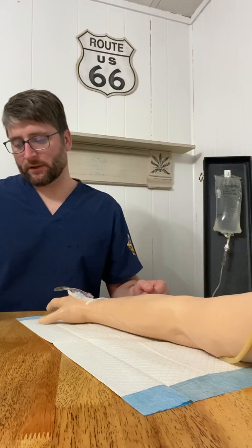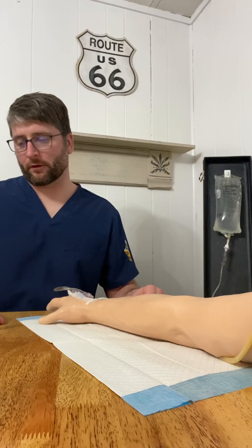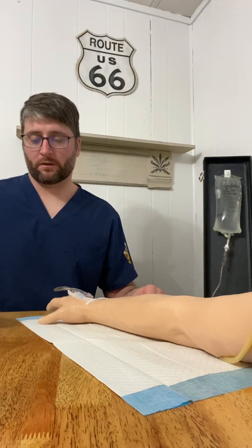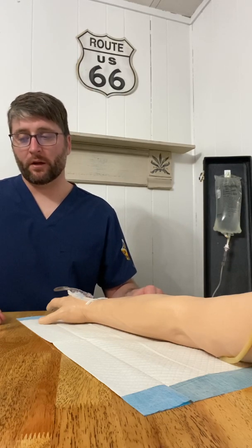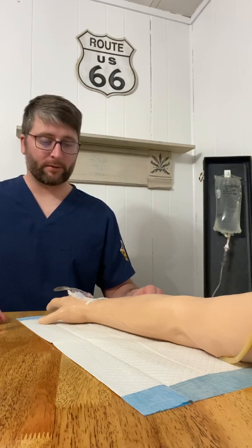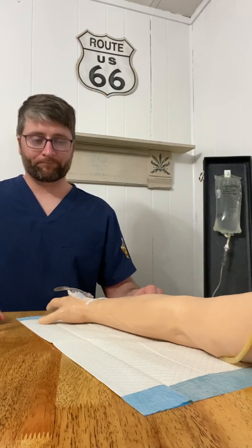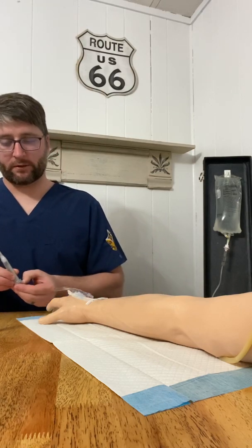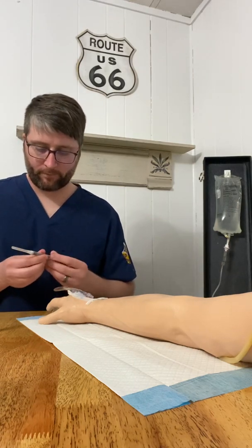We are going to be giving 1 milligram per 500 milliliter. This medication is 1 milligram per milliliter, and we're going to put that into our 500 ml bag, and we're going to run that as prescribed, and then we're going to make sure that we calculate that out correctly. So what we're going to do now, let's pull that up. We said it's going to be 1 milliliter that we are going to do.